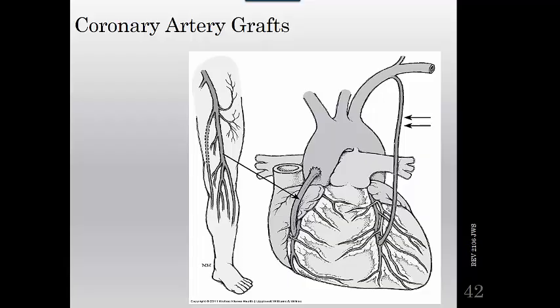However, angioplasty has its shortcomings. First, the opening created by the angioplasty is not very smooth. This is because the areas of stenosis are typically made up of atheroma, which after the channel is expanded results in gradual restenosis of the vessel. Coronary artery stents were designed to overcome some of those problems.